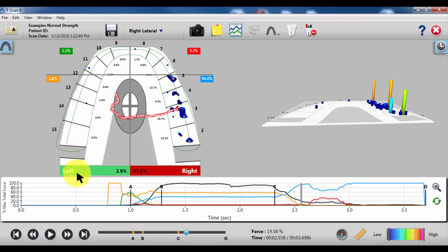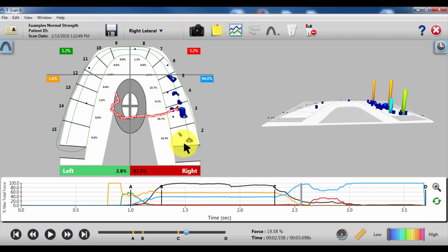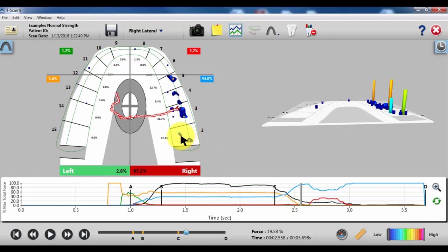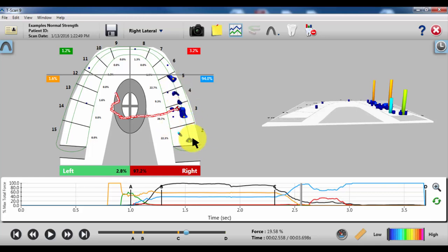The T-Scan is really showing you some cool stuff, things that you wouldn't normally see just by looking at the scratches from the paper marks. It really defines that there is a heavy force on the distal of 3, and distal of 2 is a fairly heavy force. There's a light but moderate force on 2 towards the lingual side. These are clear areas that you can mark and start to make your adjustments towards and have really definitive adjustments.